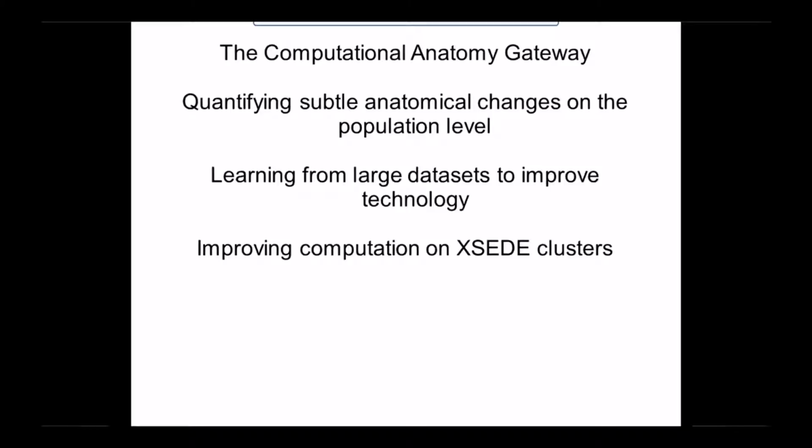So basically, for outside of Johns Hopkins, we're not accepting anything directly out of the PACS. We have a nice little simple, very thin program that the user can download if they don't currently have the data from the PACS already made into analyze format or an equivalent. In these formats, there's no information that allows the submitted images to become personally identifiable. So for everybody outside of Hopkins using the MRI Cloud, we force them to keep all of that on their side, and we don't have any of that on our side for any of the data.